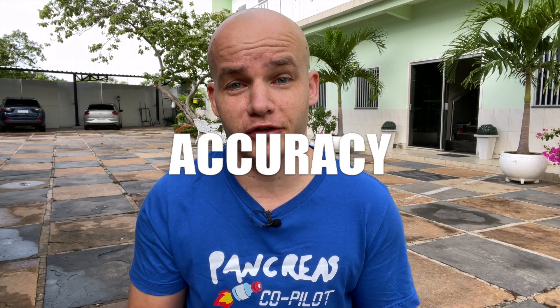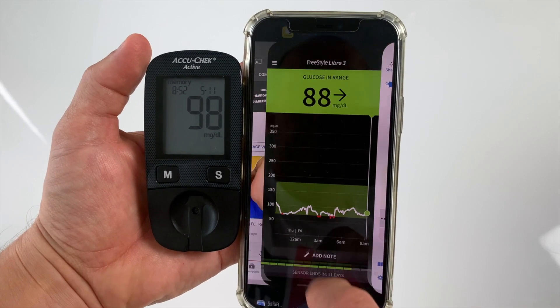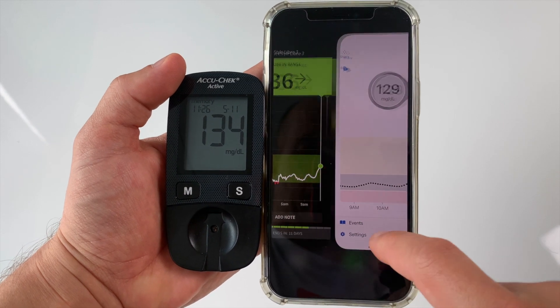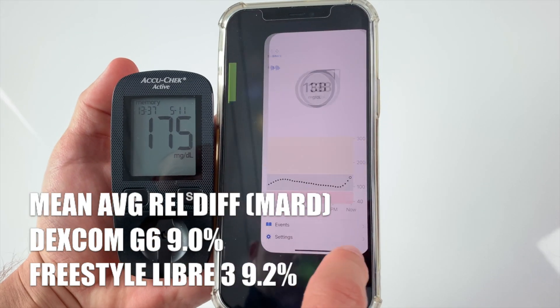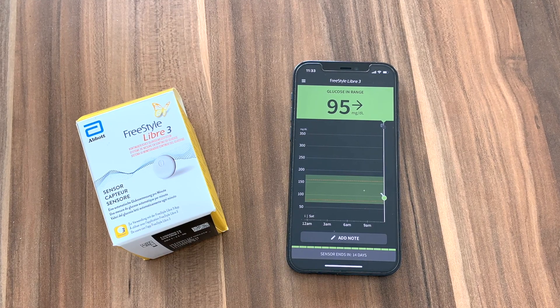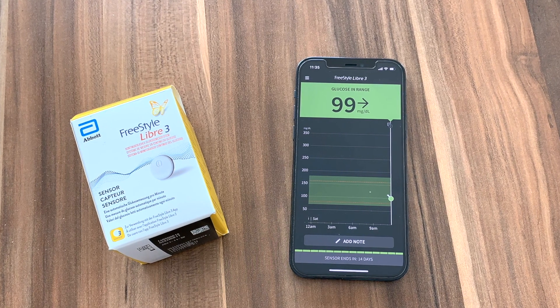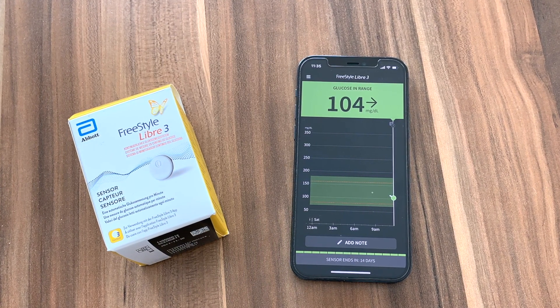Now I want to talk about accuracy of these two systems, and that's where this battle gets really interesting. Both Libre 3 and Dexcom G6 sensors are calibrated in the factory, so you just put them on and start using them — there is no calibration needed on the user side. On paper, Dexcom G6 is slightly more accurate with an overall mean average relative difference of 9% compared to Freestyle Libre 3's MARD of 9.2%. But Libre 3 actually feels a lot more accurate than that, and it's probably because it's a real-time minute-by-minute CGM — the glucose value on Libre 3 updates every minute, while with Dexcom G6 it only updates every 5 minutes.